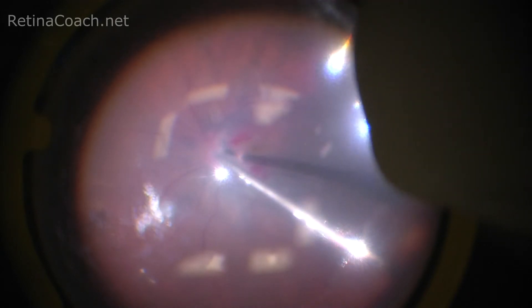Visualization of a small amount of residual heavy liquid can be difficult due to its transparency. Techniques to assure proper removal of PFC exist.